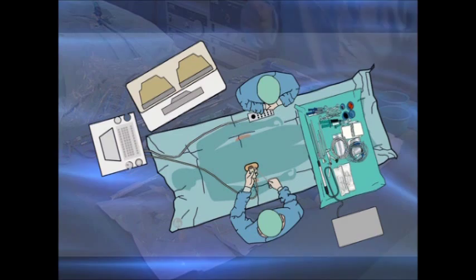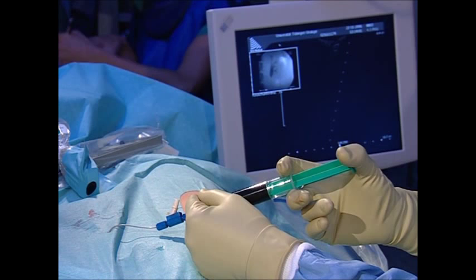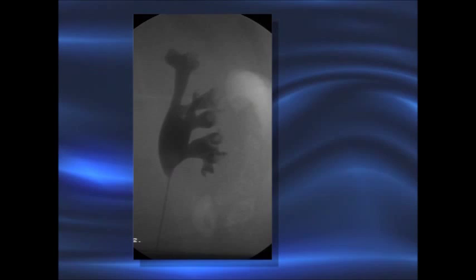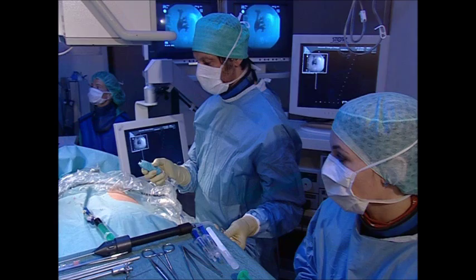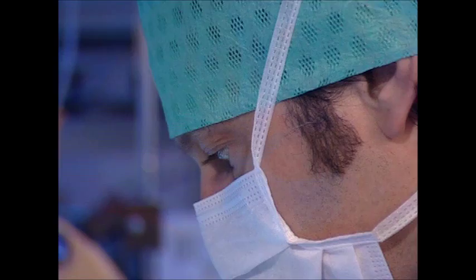Through the balloon catheter's working channel, the renal collecting system is gently filled with blue-dyed contrast medium. X-ray monitoring is used to prevent intrarenal reflux. The puncture guide is attached to the ultrasound probe. The multi-part puncture needle is inserted into the guide after pulling the needle tip back into the sheath, which prevents deformation of the tip.